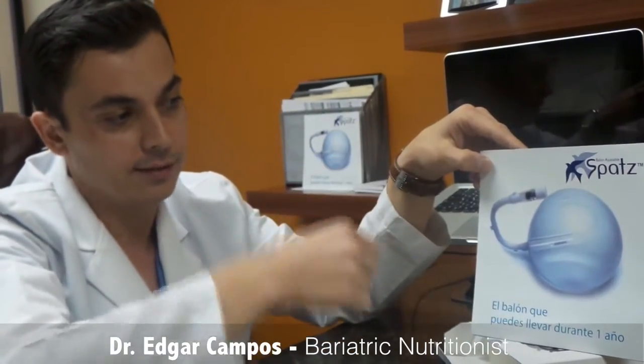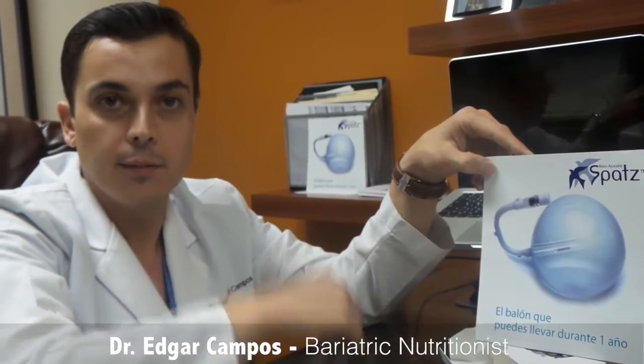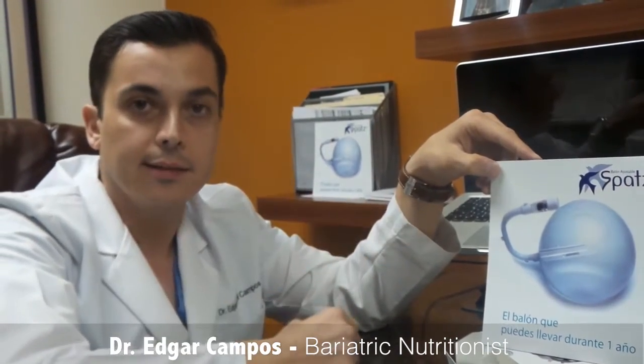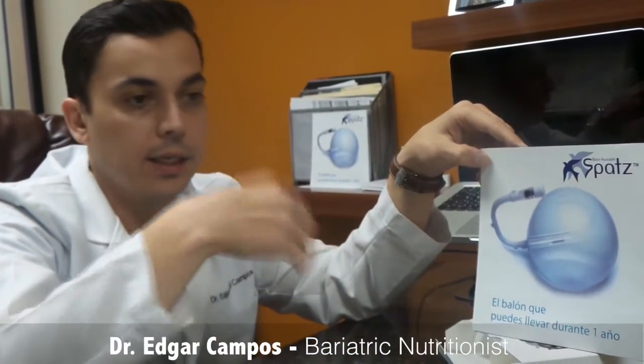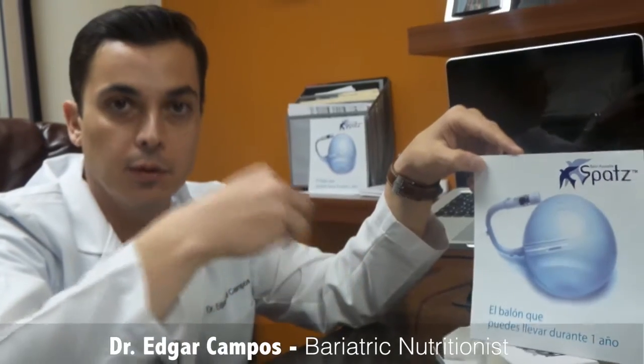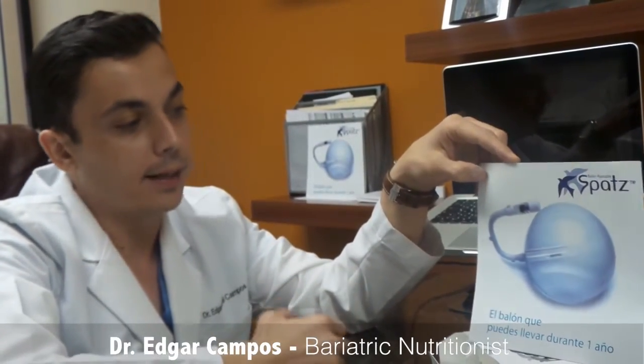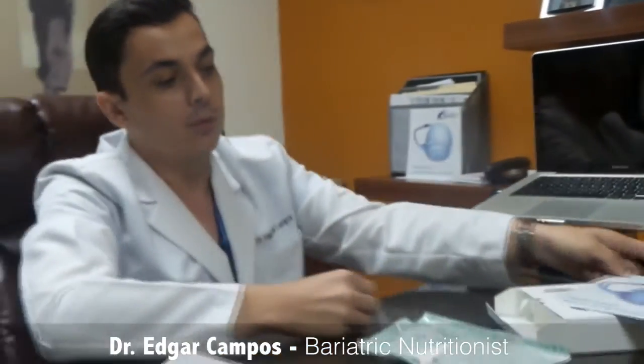The last advantage is that the balloon comes with a rubber hook inside. So basically, if the balloon deflates, it's not going to migrate to the intestine — it will stay in the stomach. That allows us to go without a rush, pull the balloon out, and then continue with a proper diet.